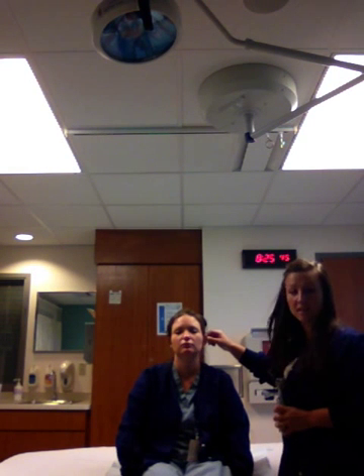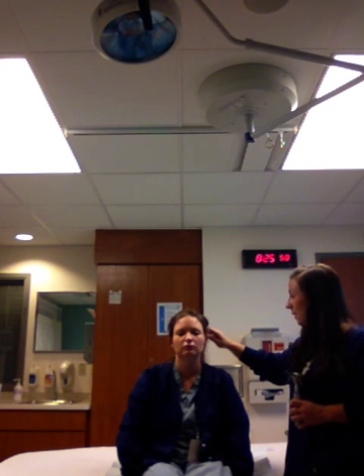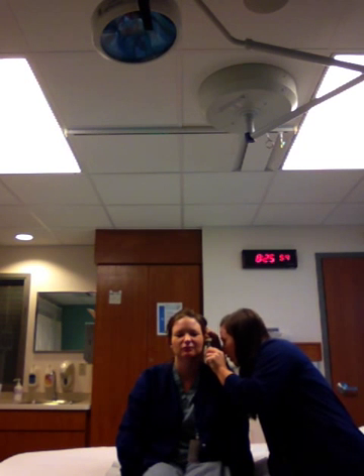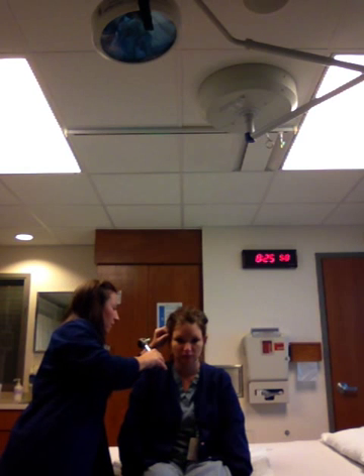And how you inspect the ear is you pull the pinna, or the top of the ear, up and back. And then you gently insert the otoscope. And you do that on each side.